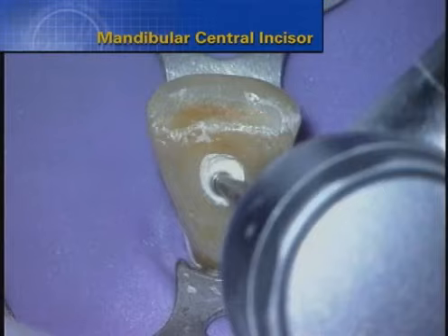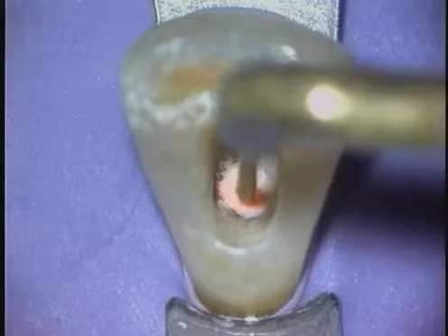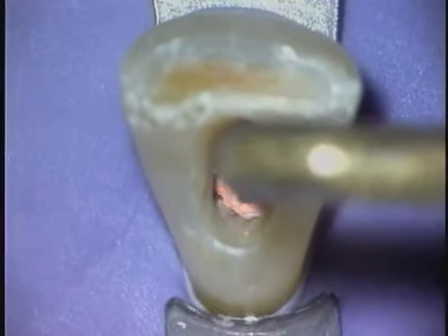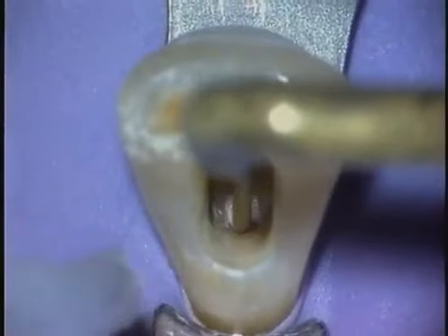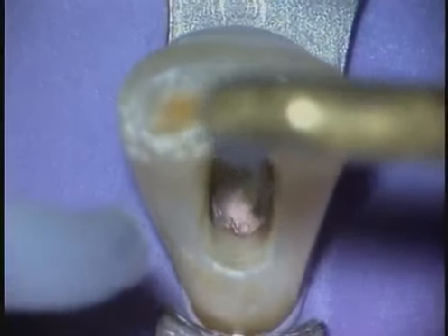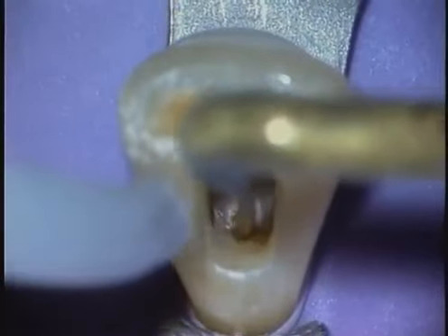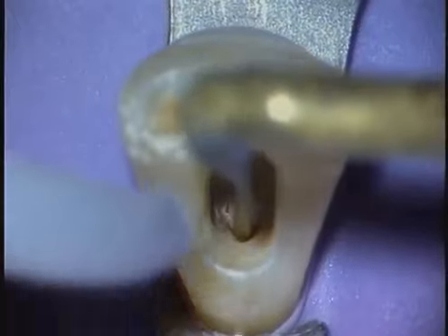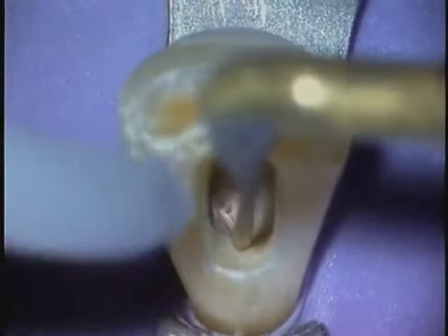When accessing mandibular incisors, we need to always be aware of the possibility of an extra canal. Microsonics is a combination of ultrasonics and magnification with the microscope, and this affords unsurpassed vision when working in these very small teeth. The canal that's typically located is the facial branch. The one that we usually don't find and the one that we should suspect is more lingual. Therefore, access cavities have to be driven towards the lingual at the expense of the cingulum.